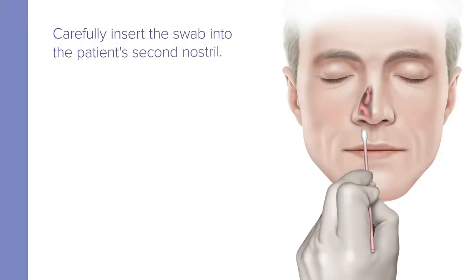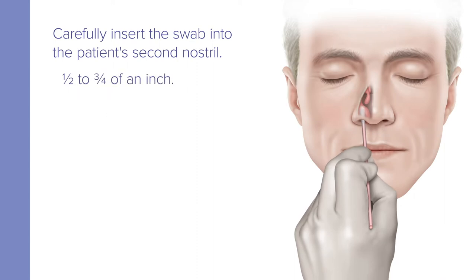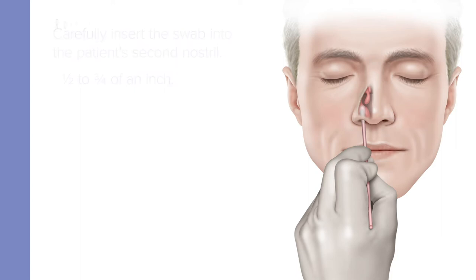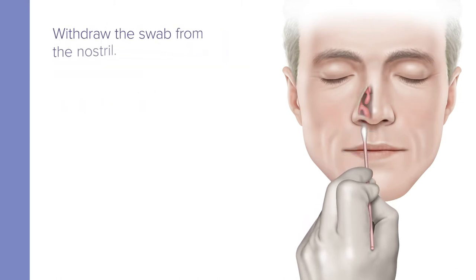Using the same swab, carefully insert the swab one-half to three-quarters of an inch into the second nostril until resistance is met at the level of the turbinates. As before, rotate the swab with moderate pressure against as much of the wall of the anterior nares regions as possible, in a large circular path at least four times, which is about 10 to 15 seconds. Then remove the swab from the nostril.